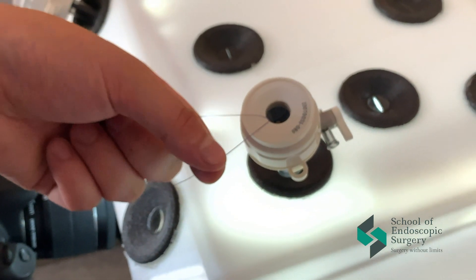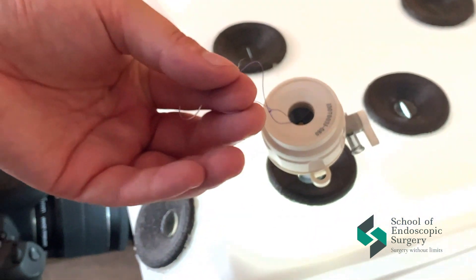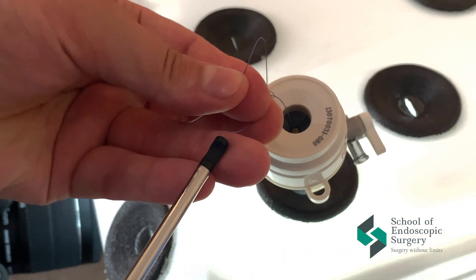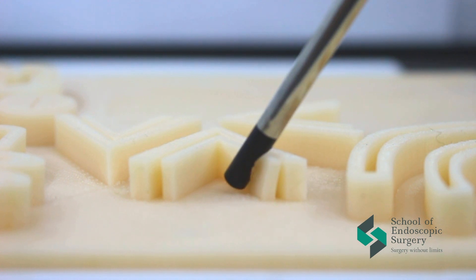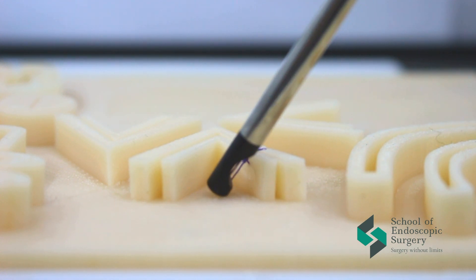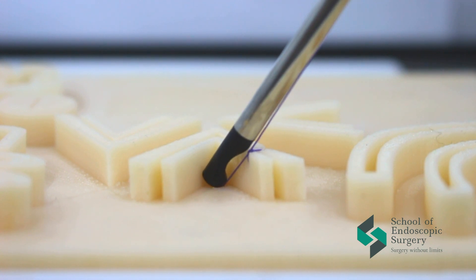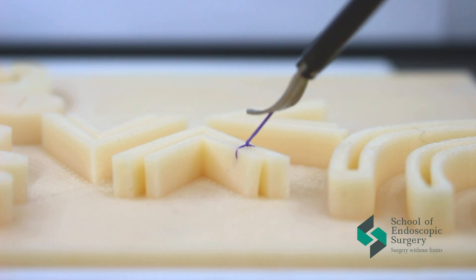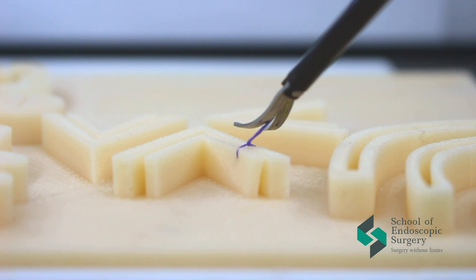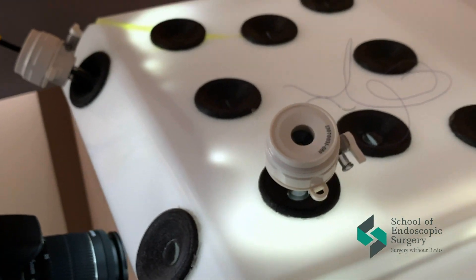One end of the thread is stretched with the knot pusher and the other end of the thread is stretched by hand. After that, form a knot on the other side, pull through the knot pusher ring, and tighten the knot. The main difference between the extracorporeal knot and the intracorporeal knot is that we can control the tension of tissues and the tension of the thread with our fingers.